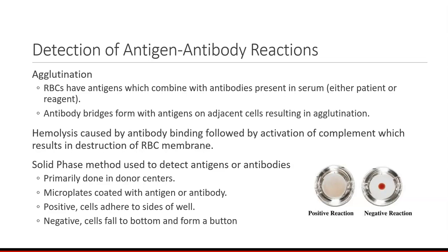You cannot see these little bitty antibodies going on to their little itty bitty antigens. You cannot see sensitization. What you can see is that when enough of these form a complex, agglutination will occur, which is a visible reaction, which is a positive reaction, indicating the presence of antibody to specific antigens.